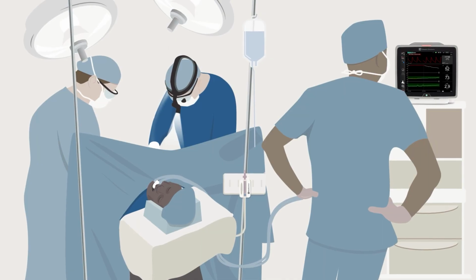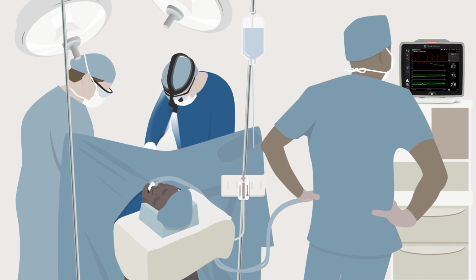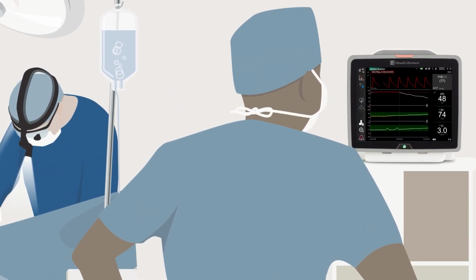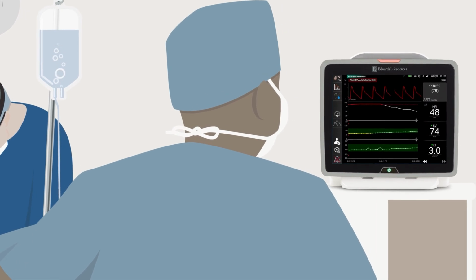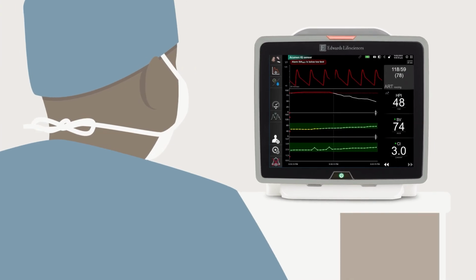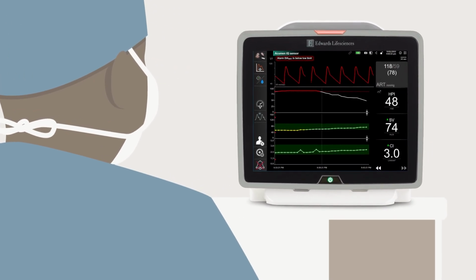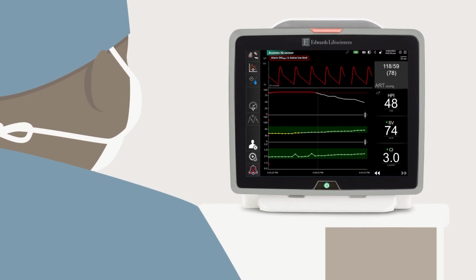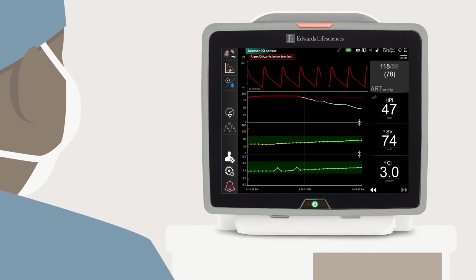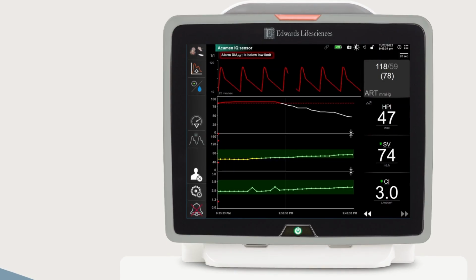In the OR setting, I normally assess fluid responsiveness after induction of anaesthesia and intubation and administration of positive pressure ventilation. Several small fluid challenges can be administered until stroke volume does not increase more than 10% or until stroke volume variability is less than 13%. This way we are optimizing the patient's cardiac output and volume status prior to the surgery commencing and after physiological changes from drugs and ventilation. This makes it easier to detect any changes than if monitoring is initiated later within the surgery.